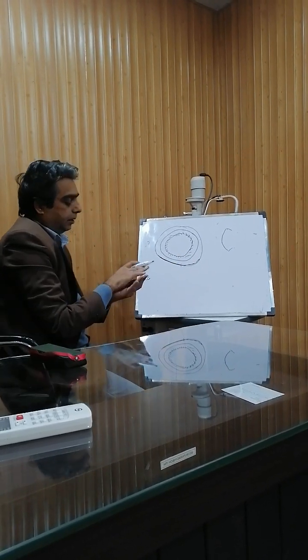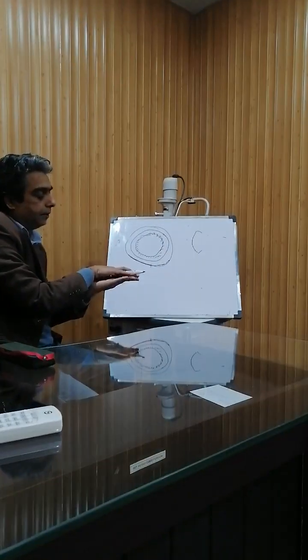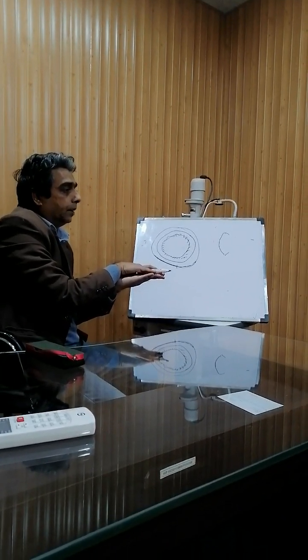Now you can see that the anterior and posterior lips can be opened.